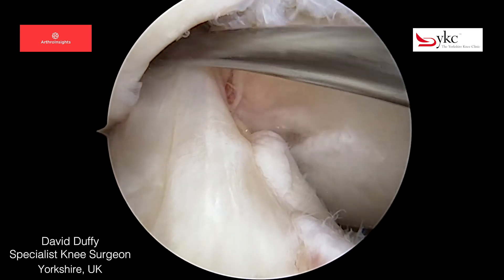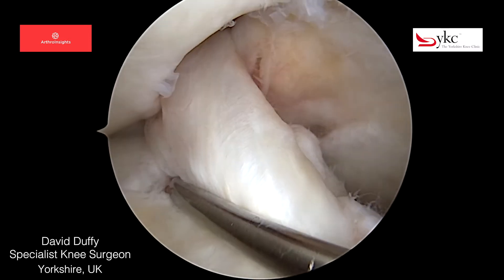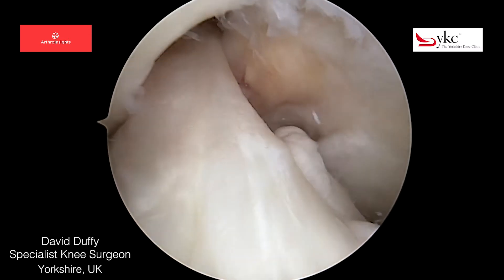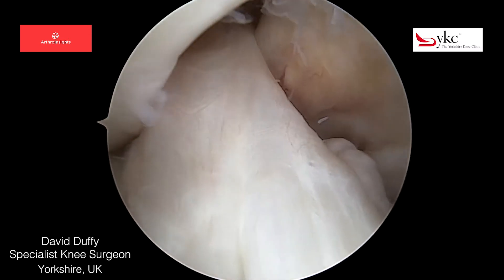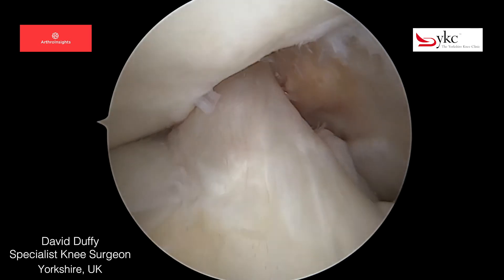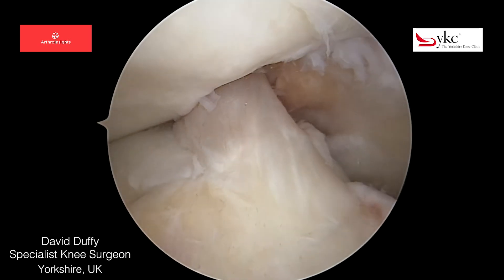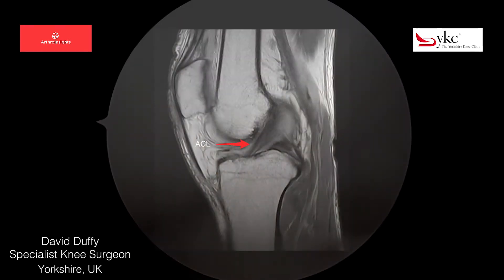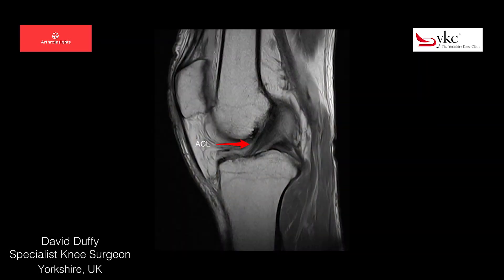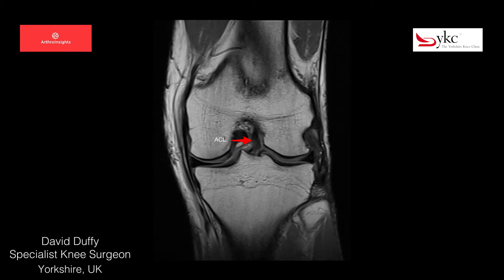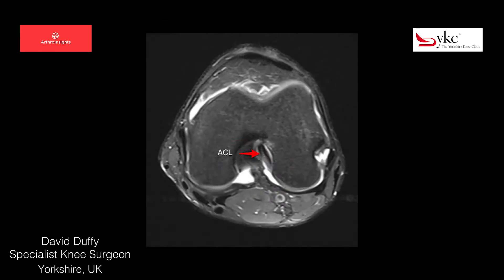Here I'm examining a normal ACL looking at three main features: the size of the ligament, its tension, and its attachment points to the bones. This is a sagittal MRI of the knee, essentially looking from the side. The ACL is the dark structure running diagonally. Identifying the ligament on the coronal and axial views can be more challenging and takes practice.